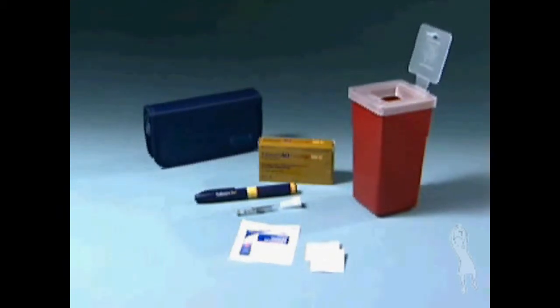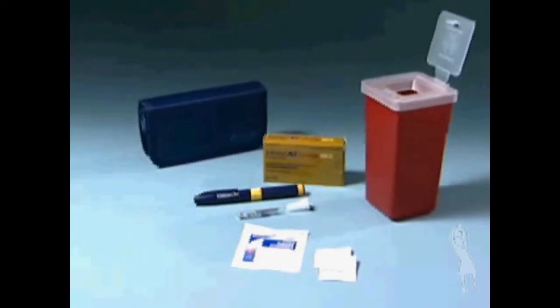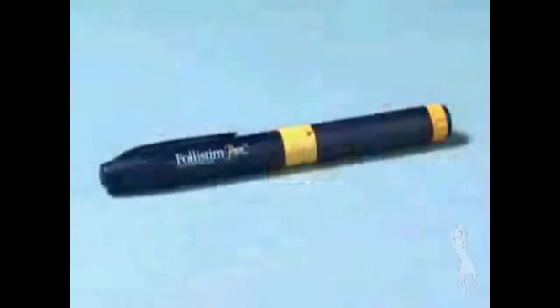Self-administering the Follistim AQ cartridge with the Follistim pen. Be sure to have all of the following items before you begin.